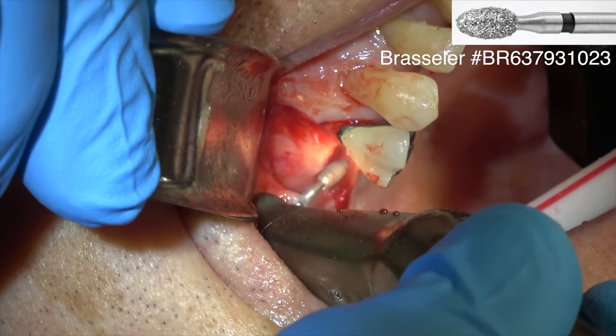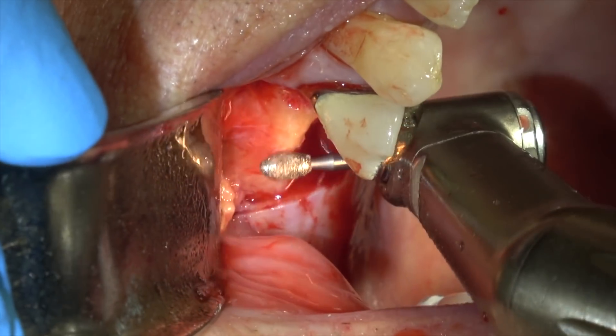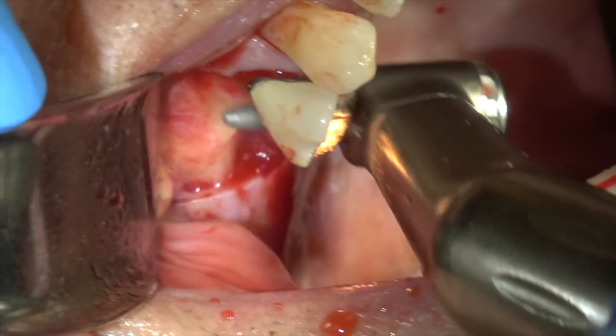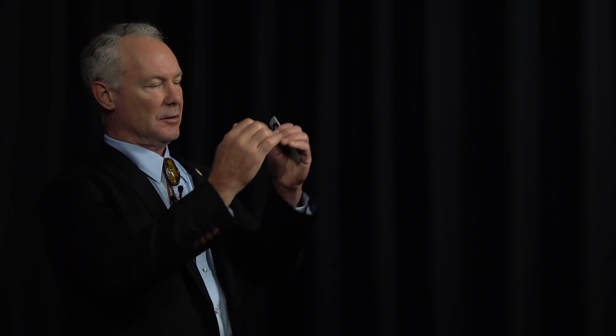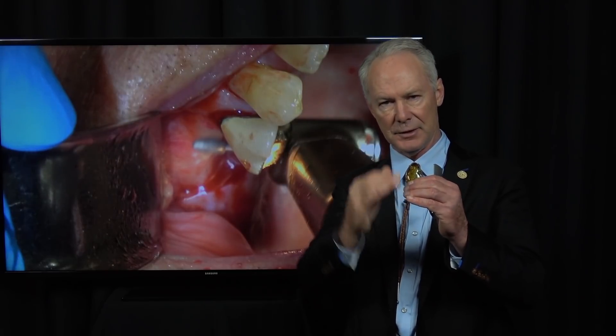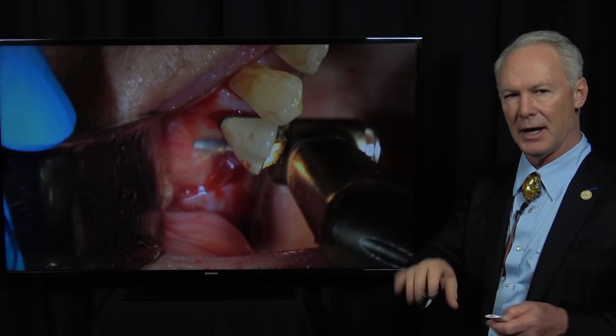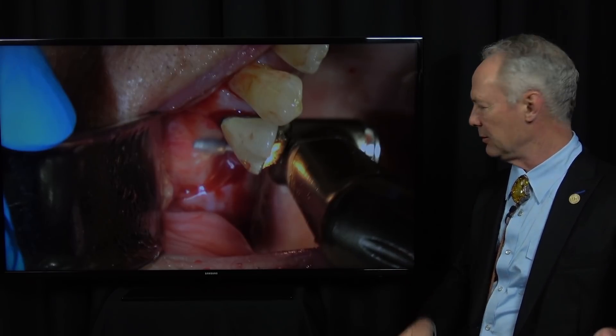I've reflected from the palatal to the buccal and exposed the alveolar crest. The alveolar crest was a bit knife-edged. I don't want to remove much, but I do want to flatten it a bit so I'm placing the implant into a flat surface and not a knife-edged ridge. This is just a coarse diamond football with lots of water and light pressure — I'm just flattening it a bit. If you've got a knife-edge ridge, all the threads will be exposed on both the palatal and the buccal.